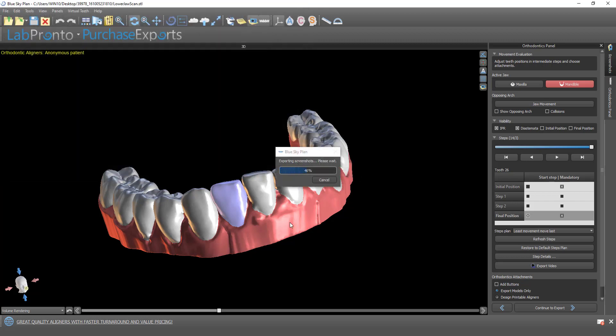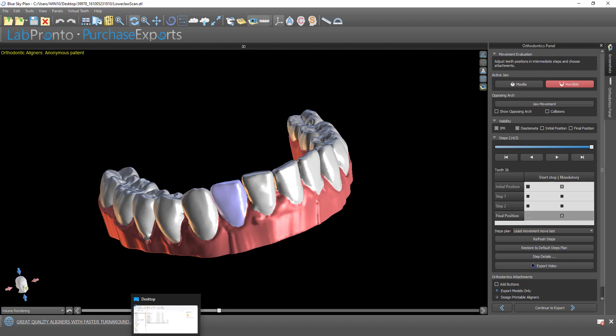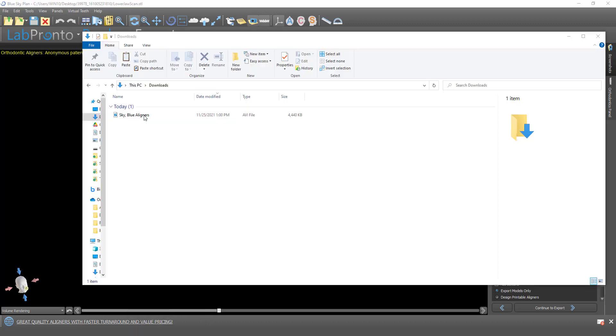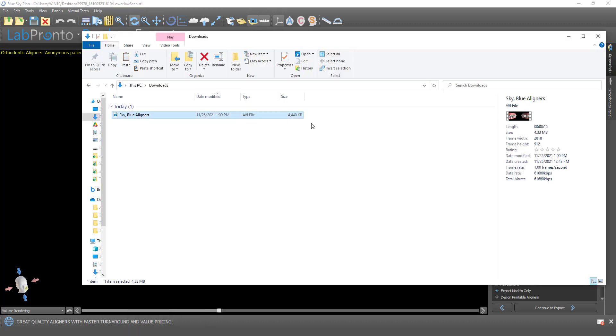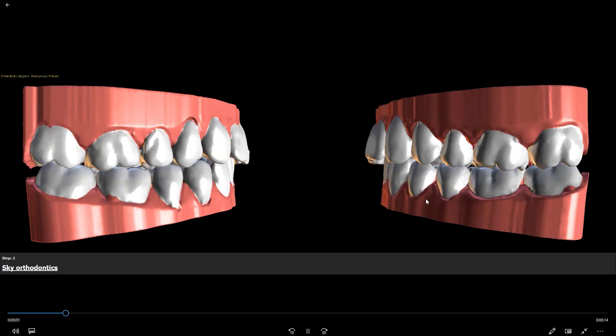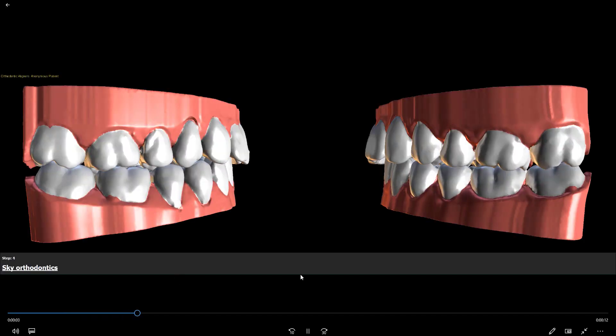I'm going to go ahead and click on save. Here is our video file. We can see it's four megabytes, so it's very small and easy to transfer and share.